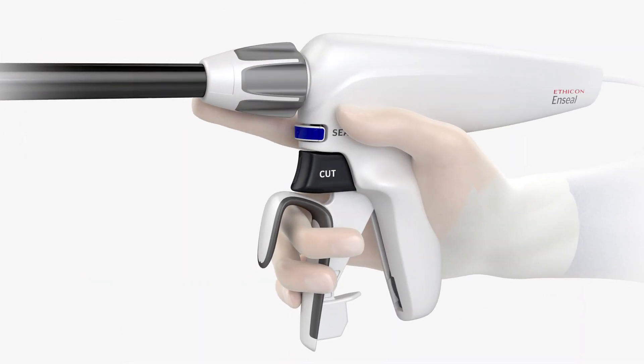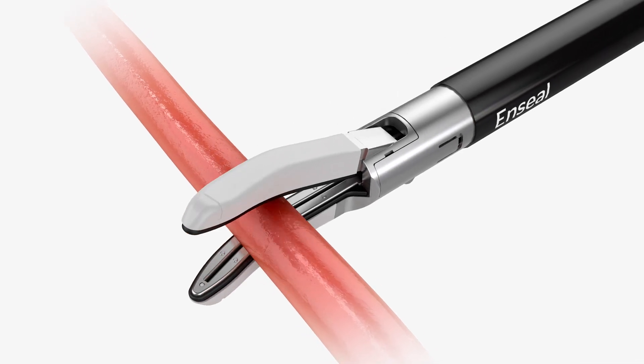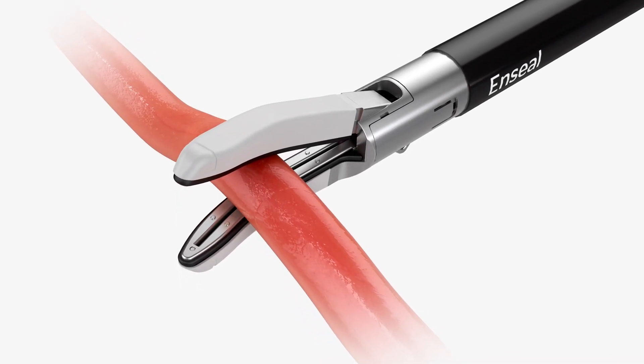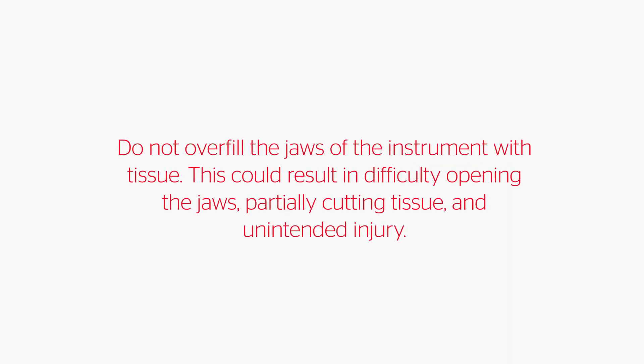Turn the rotation knob to move the shaft of the instrument to the desired position. Place the vessel or tissue at the center of the jaws. Do not grasp tissue beyond the electrode surface in the hinge of the jaws. Do not overfill the jaws of the instrument with tissue.